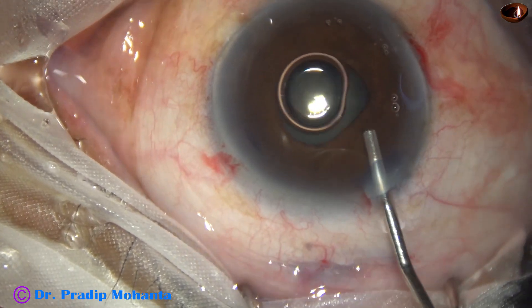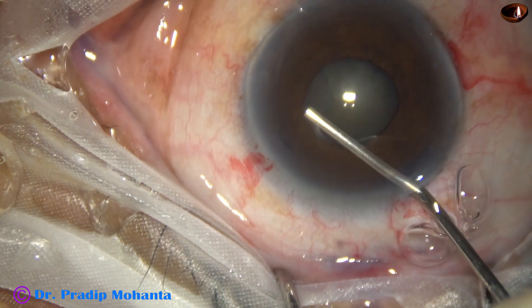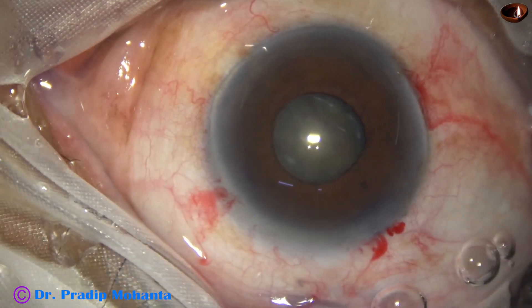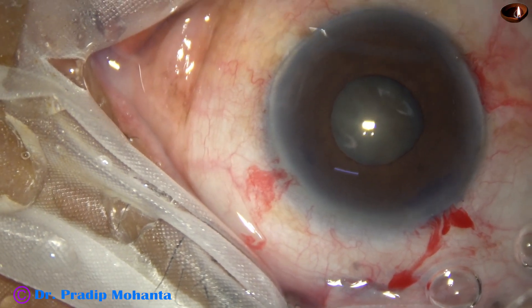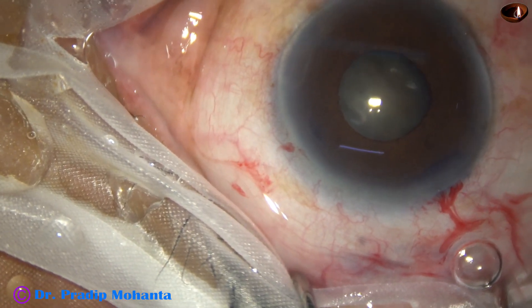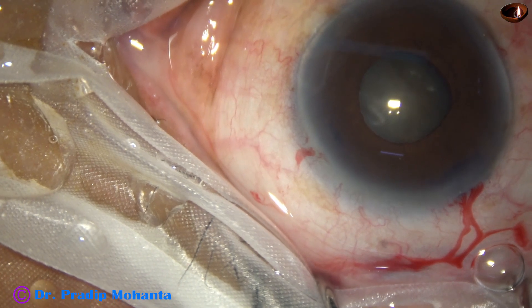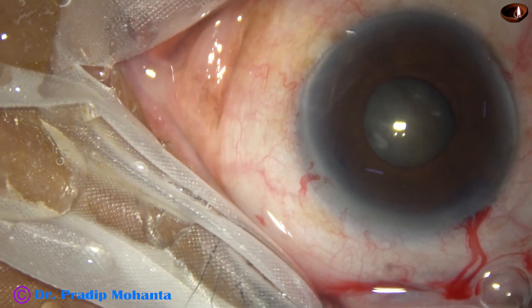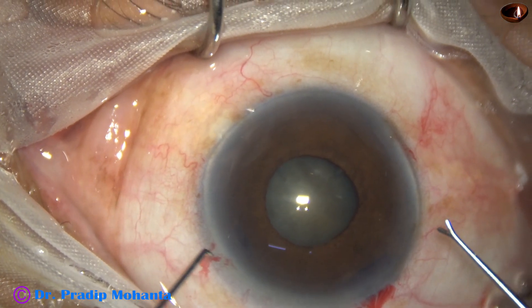So there is no other way — we have to use either iris hooks or a pupil expansion device to dilate this pupil, to expand this pupil for a safe surgery. There are surgeons who can do surgeries without a pupil expansion device in this situation, but the majority of surgeons including me do not dare to do these kinds of surgeries without using one.